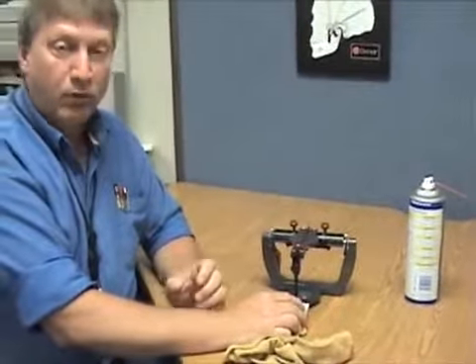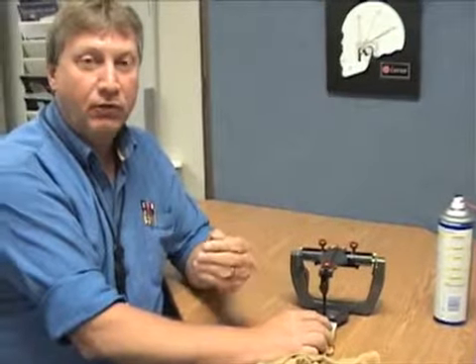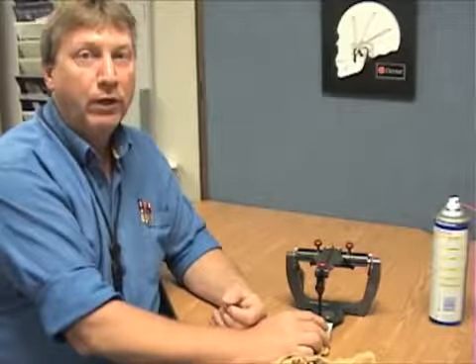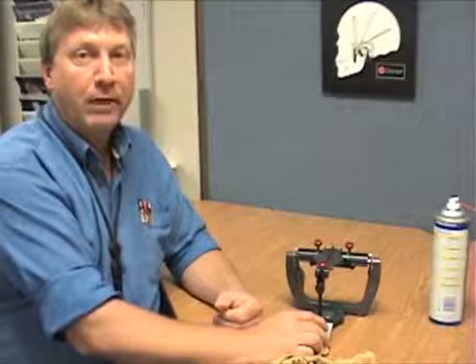Here again, the importance of doing the lubrication is that it's going to give you longer life of your articulator. It's going to give you better function of your articulator and keep things functioning the way they should, so hopefully with fewer maintenance issues.